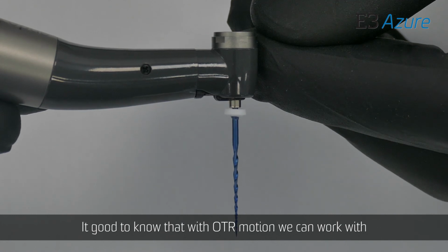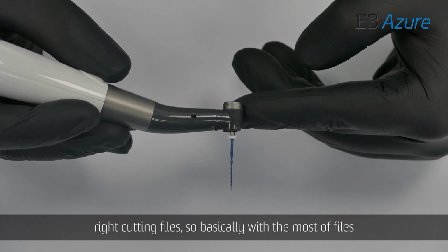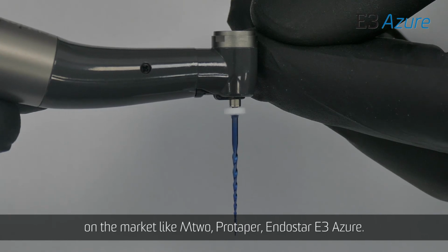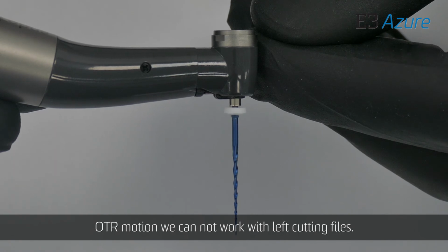It's good to know that with OTR motion we can work with right-cutting files, so basically with most of the files on the market, like M2, ProTaper, Endostar E3 Azure. With OTR motion we cannot work with left-cutting files.